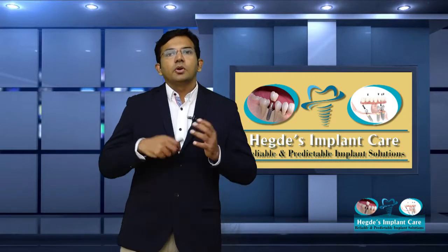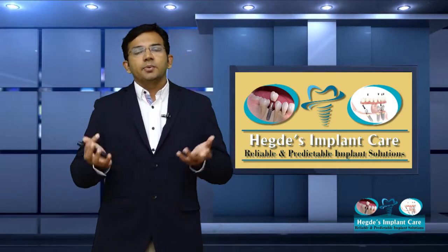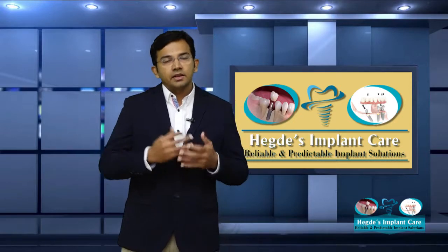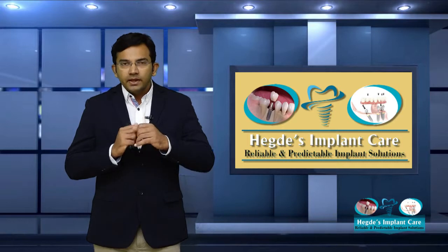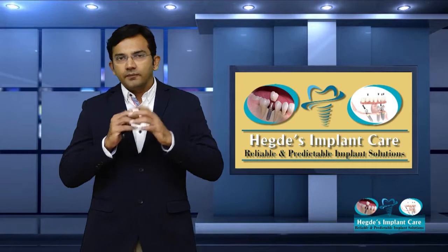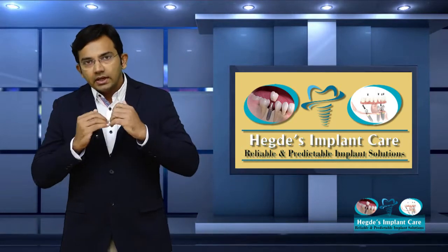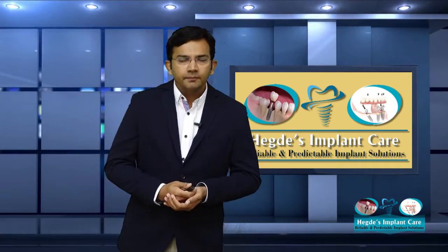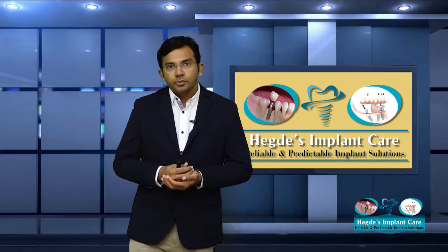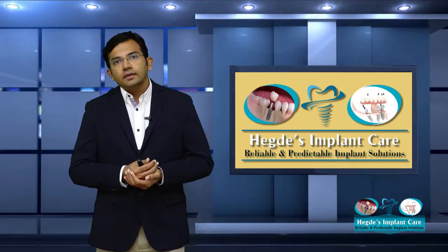The technique I have spoken about is called the indirect technique, and we generally call it a little blind procedure because we are not actually visualizing the sinus membrane, the Schneiderian membrane. But on average, we know where it is and how much it can lift. Using that knowledge, without actually visualizing the membrane, we give a tap and slightly elevate it. So it is an indirect approach, but it can be done in cases where we need to lift about 3 to 4 mm of bone. Once we have done this, we generally wait 6 months and then go ahead with the crown placement.